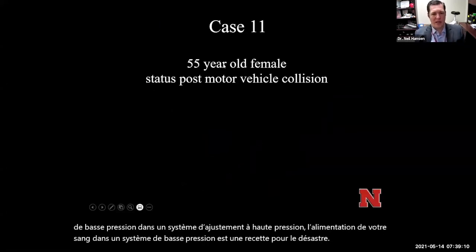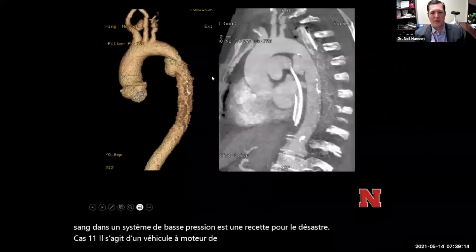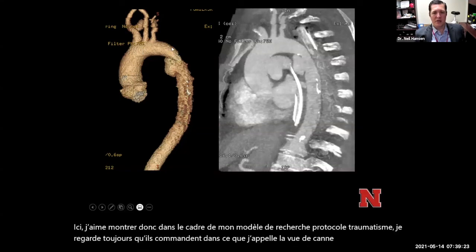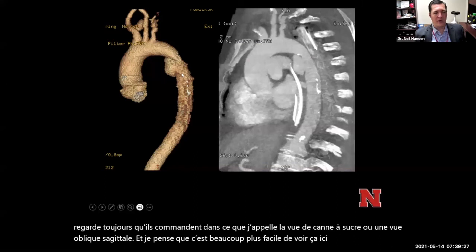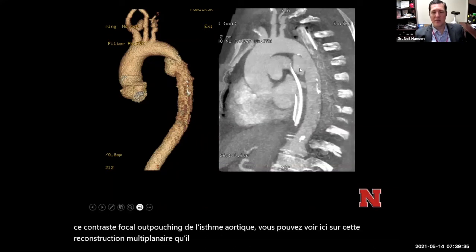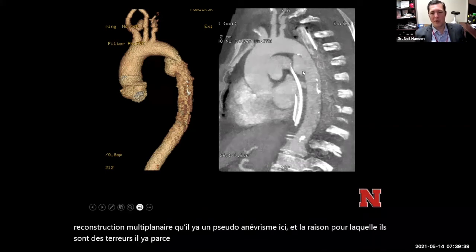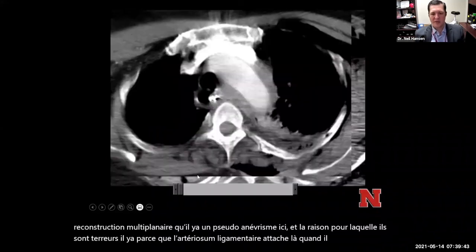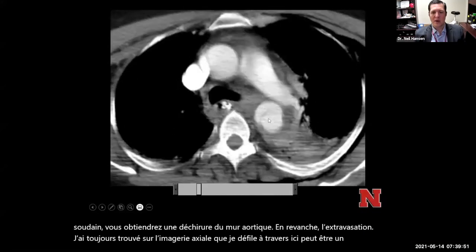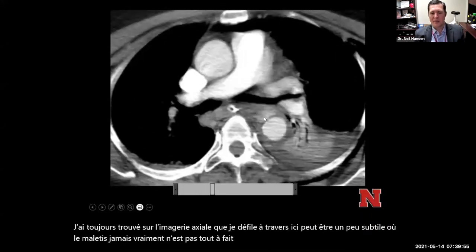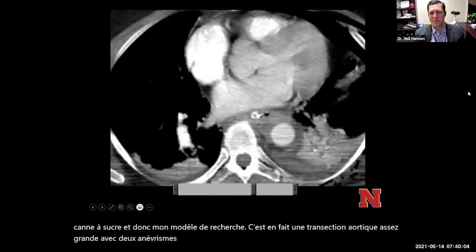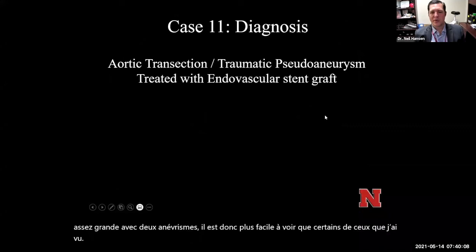Case eleven: a 55-year-old female status post motor vehicle collision. As part of my trauma protocol search pattern, I always look at the aorta in the candy cane view — an oblique sagittal view. It's a lot easier to see the focal contrast outpouching from the aortic isthmus here. On multi-planar reconstruction, there's a pseudoaneurysm. The aortic tear occurs at the isthmus because the ligamentum arteriosum attaches there — when there's a sudden stop, you get ripping of the aortic wall and contrast extravasation. On axial imaging this can be subtle, which is why I use the candy cane view as part of my search pattern. This was actually quite a large aortic transection with pseudoaneurysm, treated with an endograft.